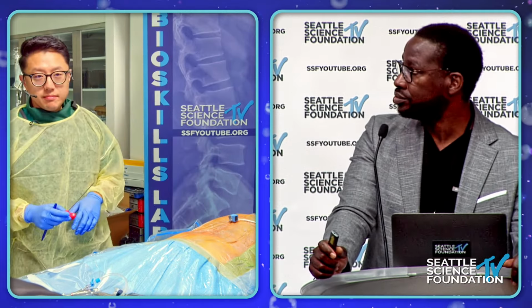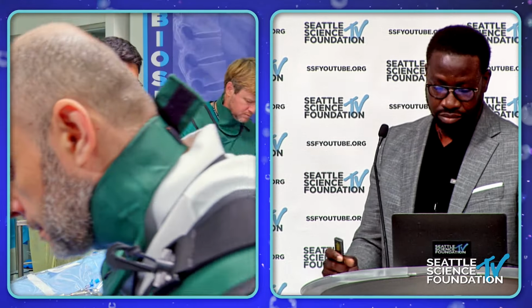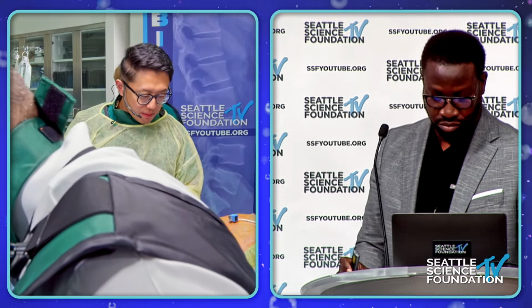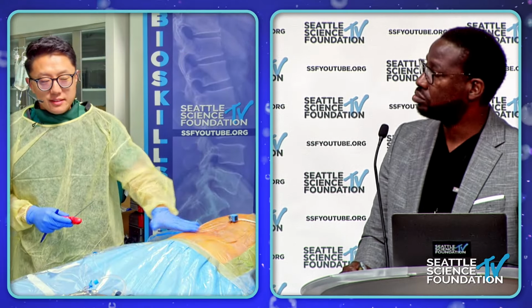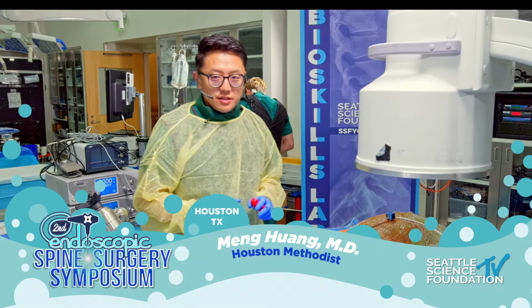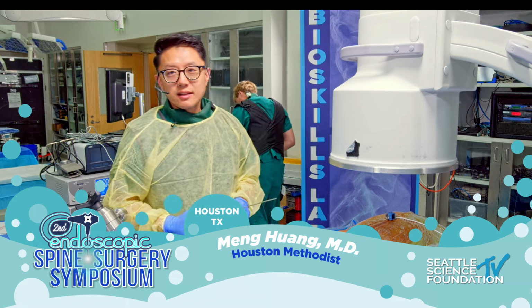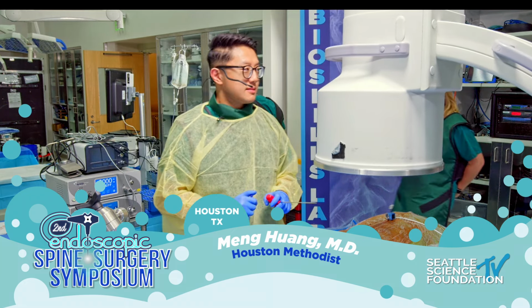Okay, so we'll go ahead and get started here. I think that slide is pretty important. It's the concept of the spinous process plane. So let's go ahead and come in and take a look at the cadaver and get our markings set. So, John, I'm doing L4-5, right? Correct. Okay. So let's focus in on L4-5.